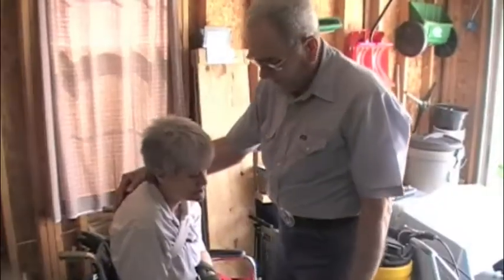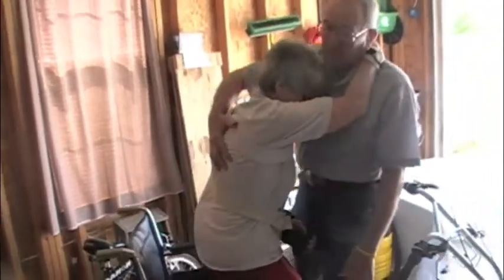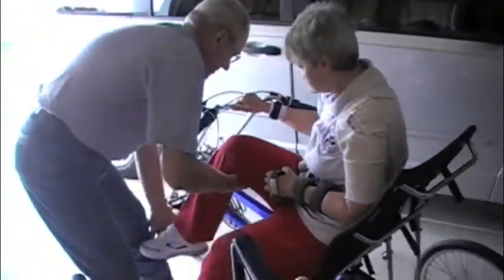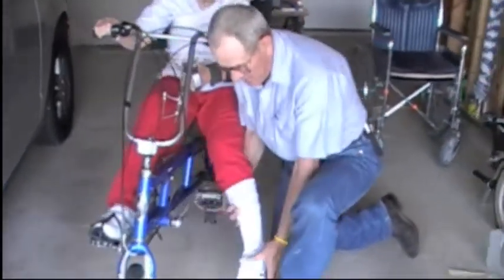We're going to load you up now — do a transfer much like we do a transfer anywhere else. Mary Beth puts her arm around my neck and all I do is stand up — there you go — and then I just lift her leg across here. I remove Mary Beth's AFO because she won't need that; she needs to have her ankle loose to follow the pedal motion.